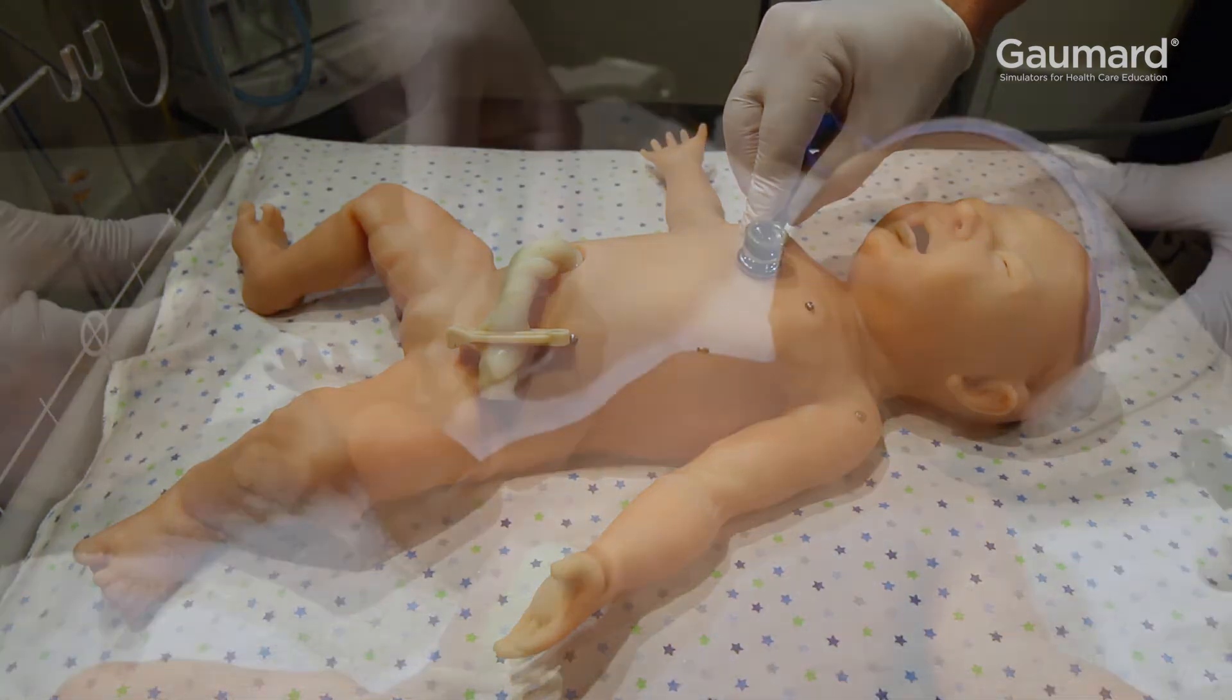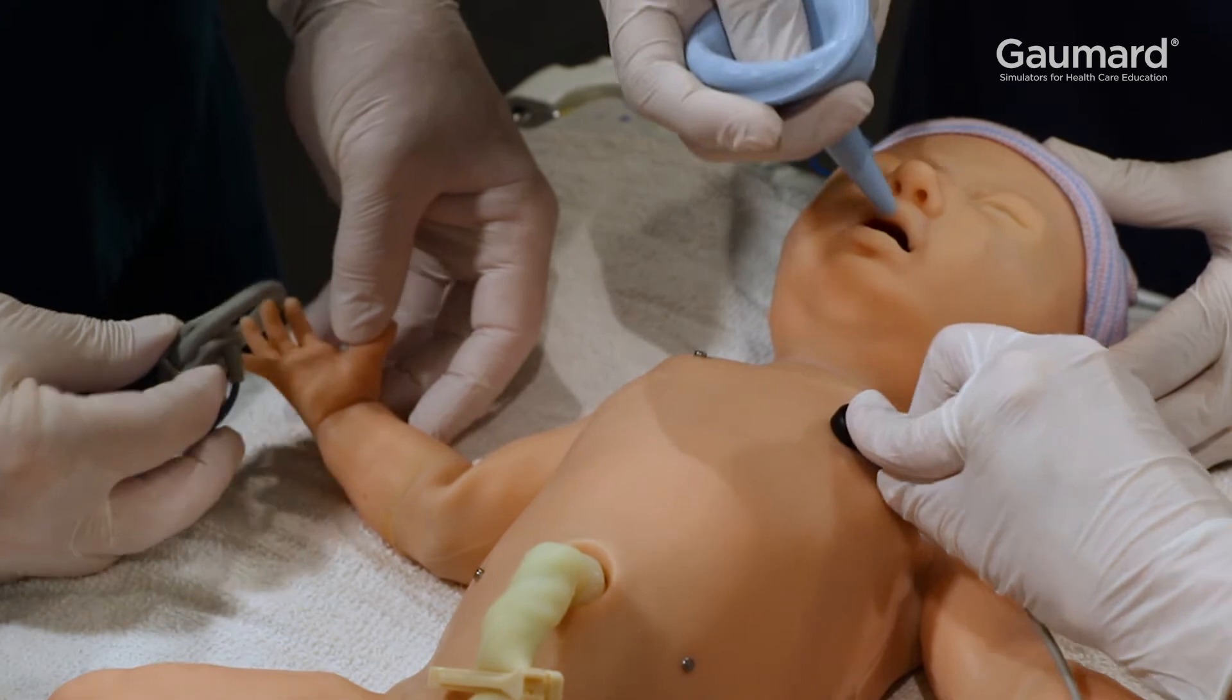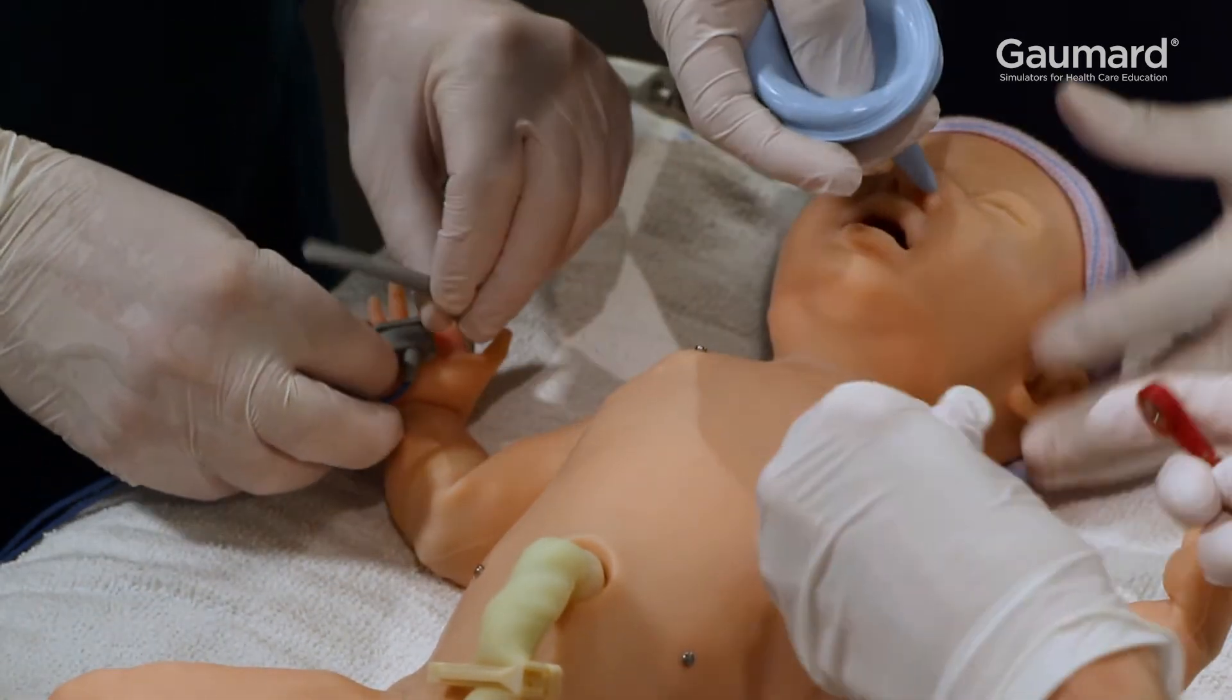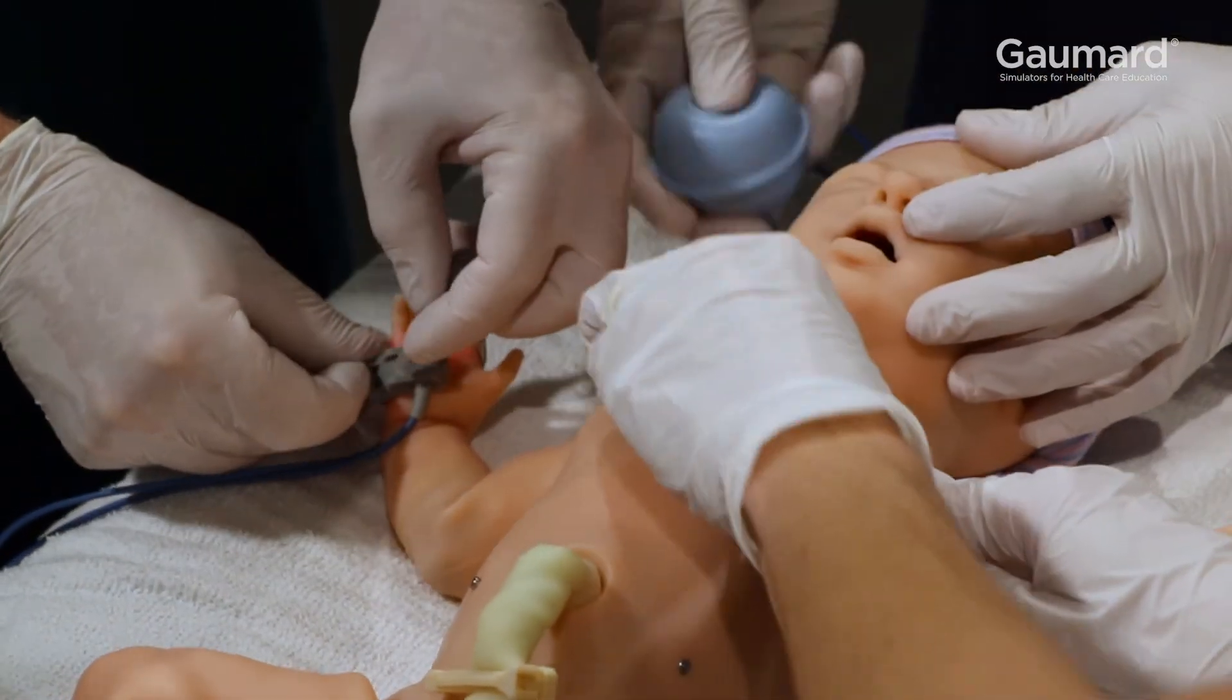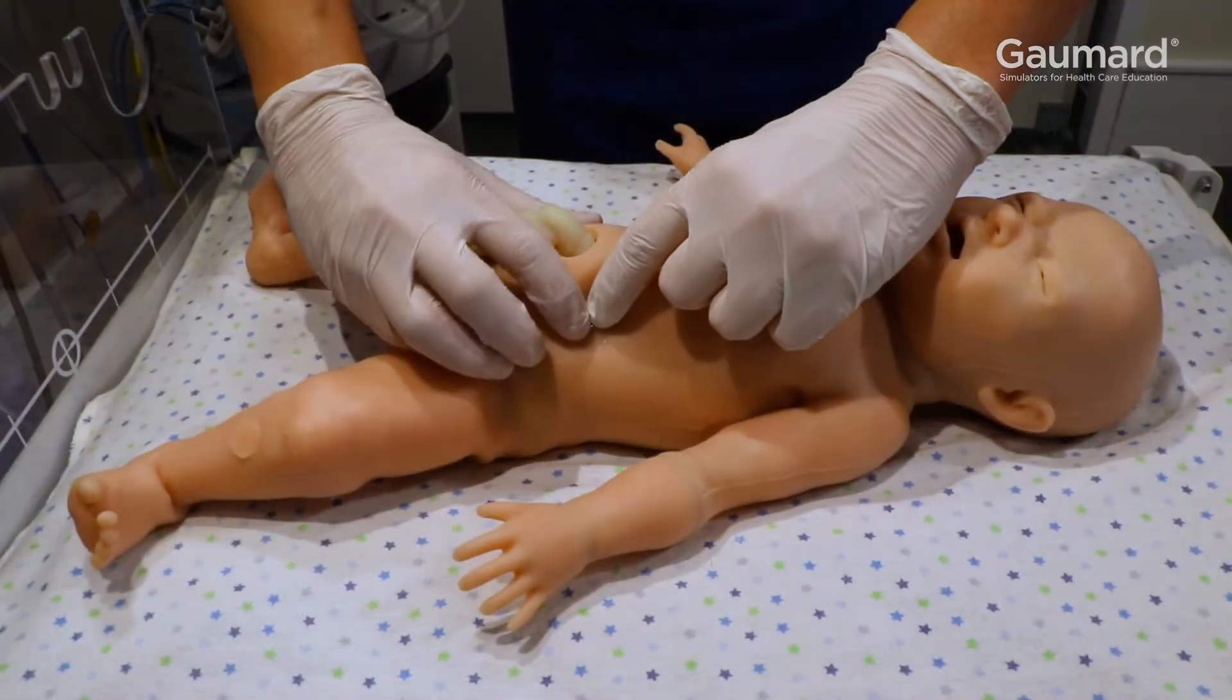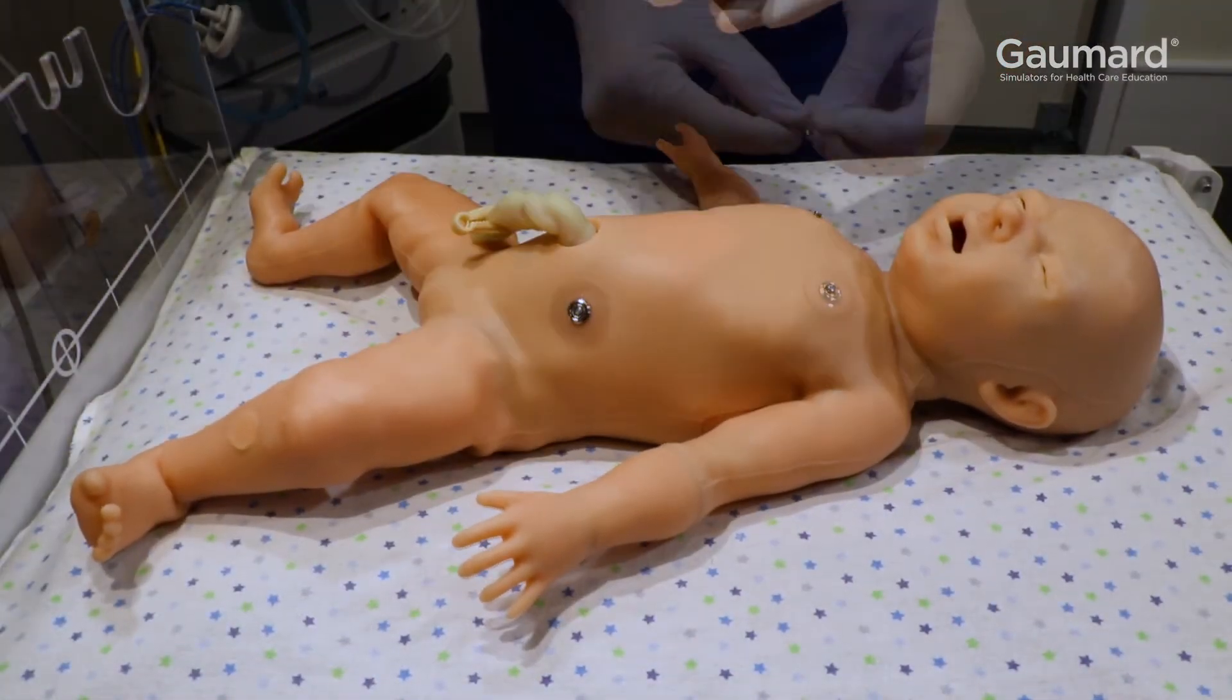By attaching electrodes to the appropriate sites on the torso, ECG rhythms can be detected using real equipment. Adapters are included for use with pre-wired disposable ECG leads.